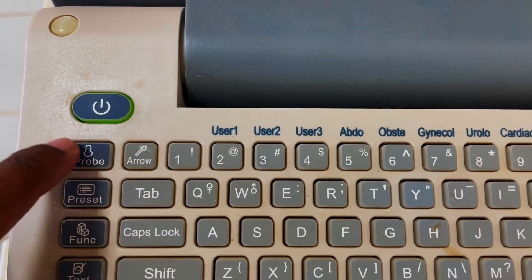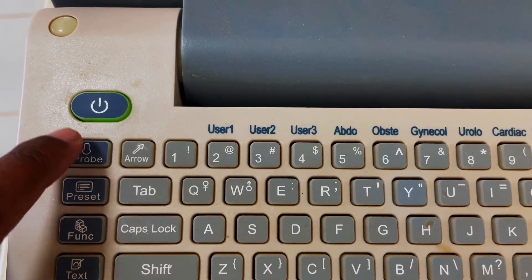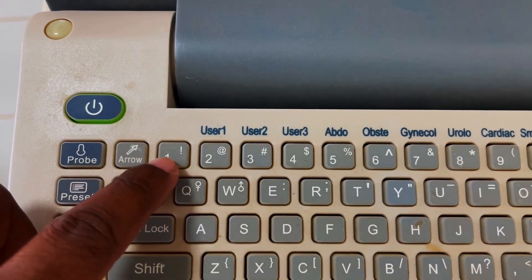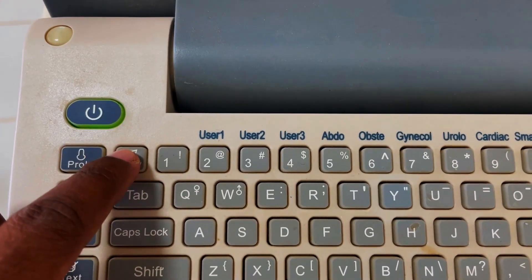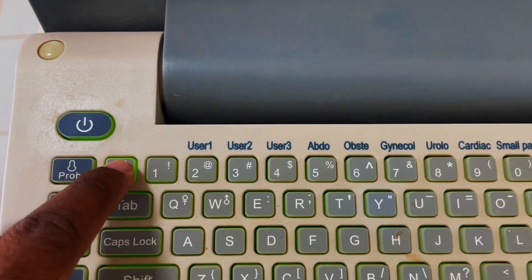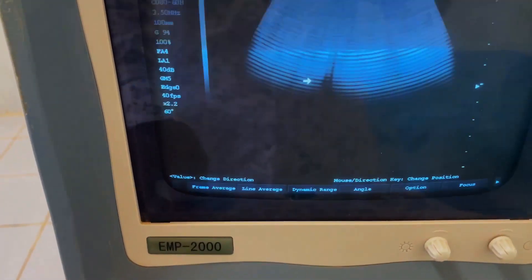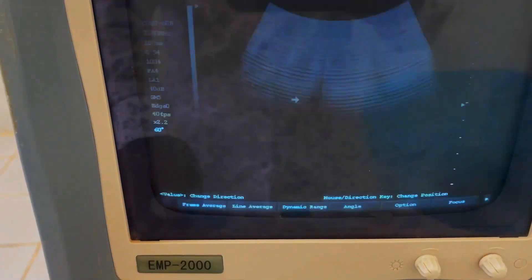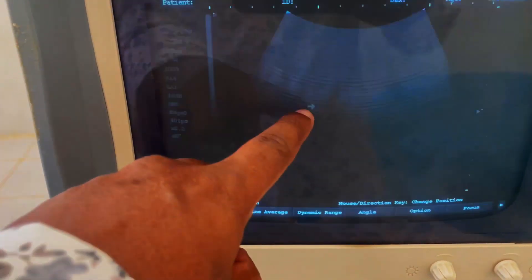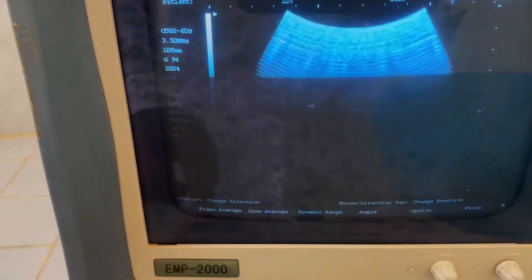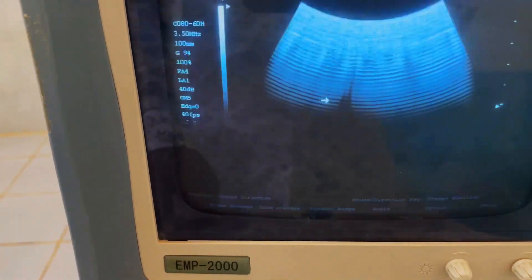This one is our probe button and this one is our arrow button. Just press it and see on the screen — your arrow is popping up. This one is your arrow.